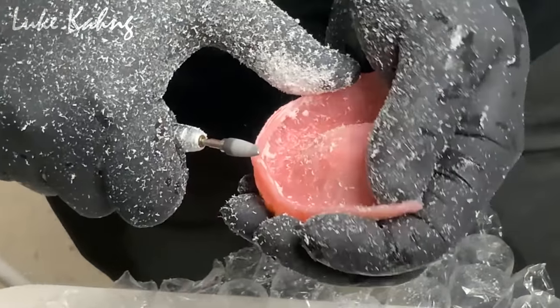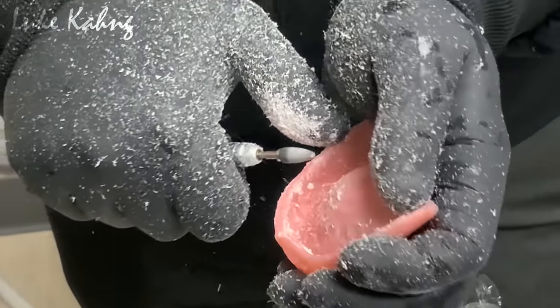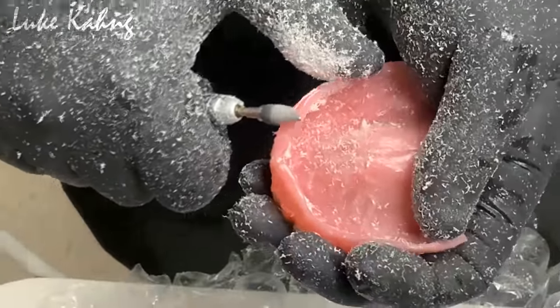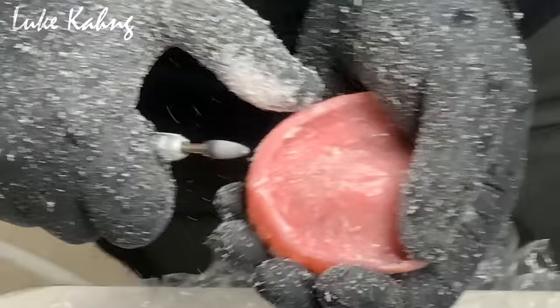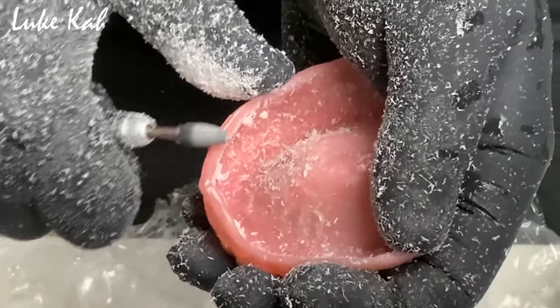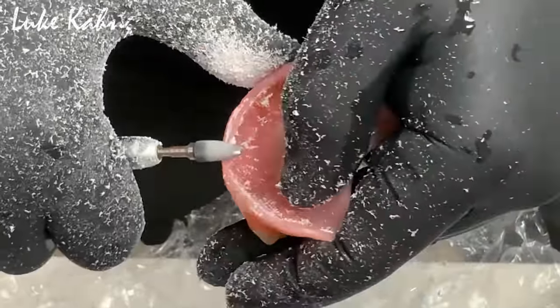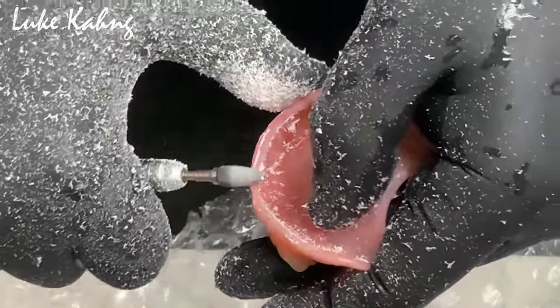Now what's the farthest that you can go in terms of trimming it down? I basically look at the sulcus, and when I try the denture in, I can see how much room is up there. This is something that you get over years and years of experience. You know where not to take too much off.